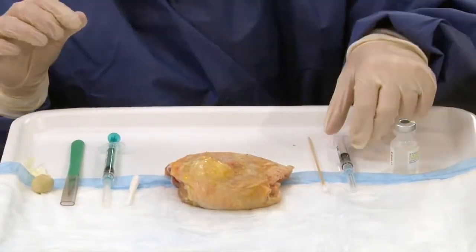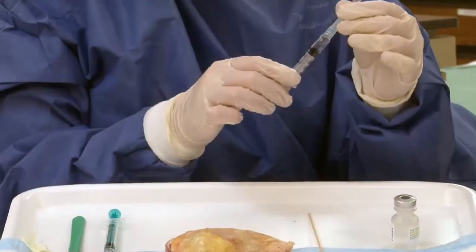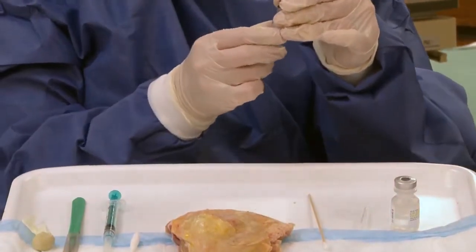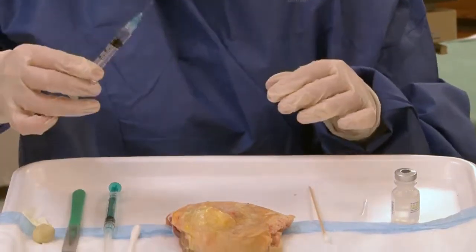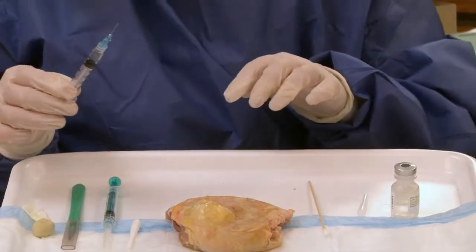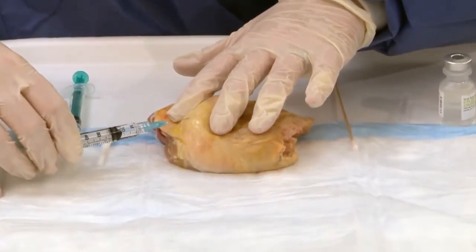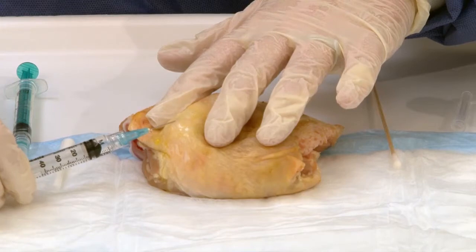Then I'm going to take lidocaine. This is just simulated with water. Simulated lidocaine, 2 to 3 cc's. And I will inject the area around the subcutaneous area to numb it before the procedure is performed. I'll pull the skin taut and then form a small wheal.